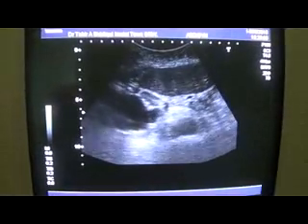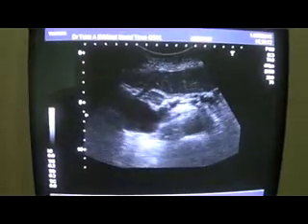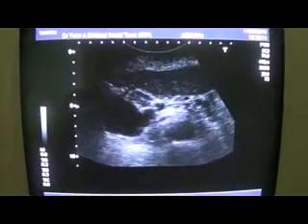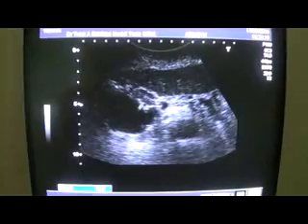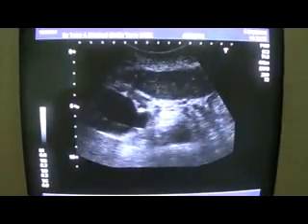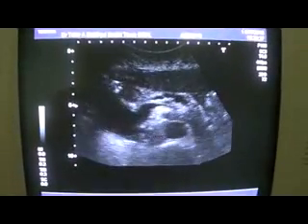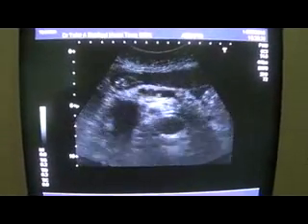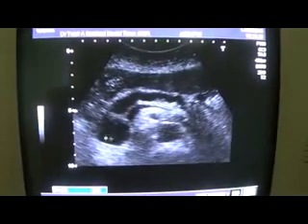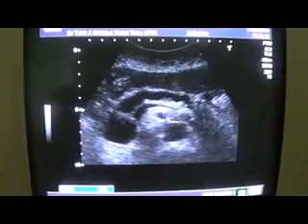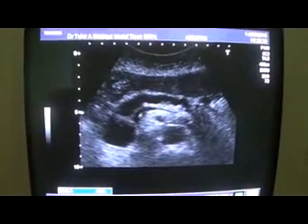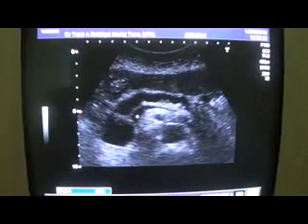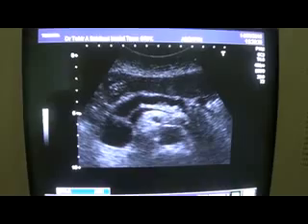Now when I come to the transverse section and place the probe transversely, this is the part of the dilated CBD. This is a small lymph node at the paracelic region. Here I am going to show you the dilated ducts of the pancreas. This is the CBD, this is the aorta, this is the superior mesenteric artery, and this is the splenic vein.